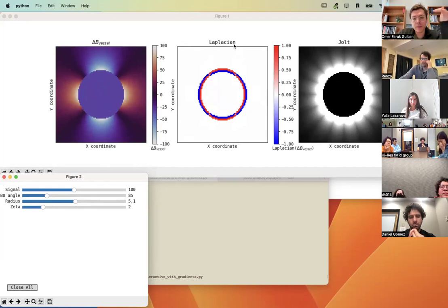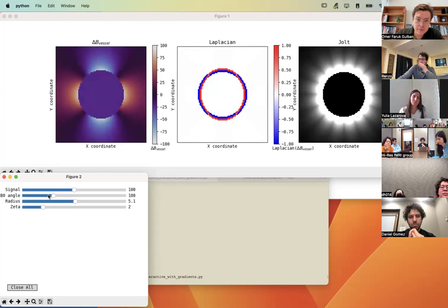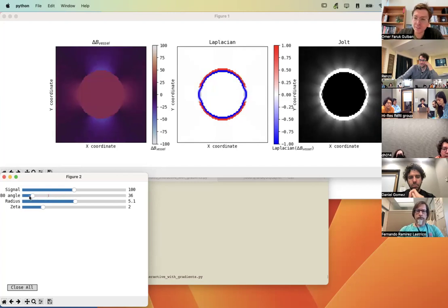And what I'm plotting here is the Laplacian. This is a spatial derivative of these magnetic field distortions, the L1 norm of the second spatial derivative. And hopefully you can see that, look, I'm changing the B0 angle, and there is some change in Laplacian. You see, there's this crossing point. And these are very much a work in progress, by the way. I hope I coded everything correctly, but don't quote me on that in the future. This is very much experimental right now.